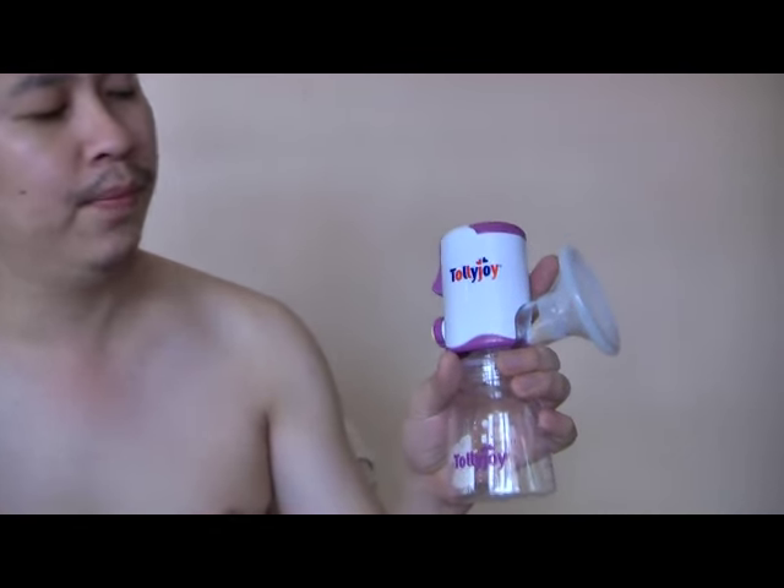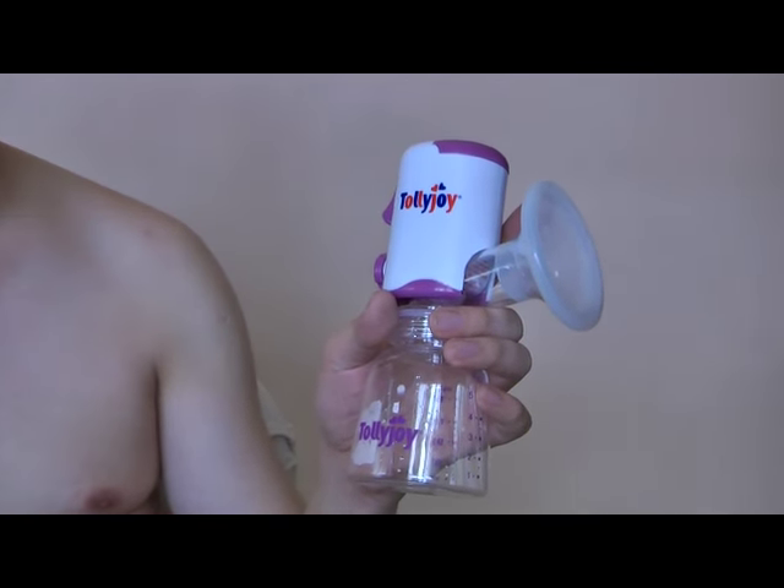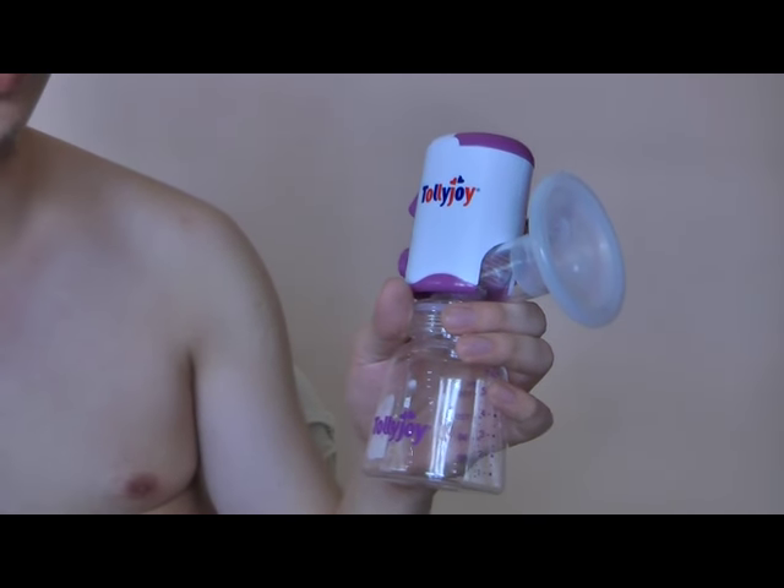Hi, my name is Vincent Cheng and I'm from NextGenParenting.com and today we are going to review a breast pump because my wife Joanne just gave birth to our daughter Victoria and we have tried some manual pumps and it's actually really time consuming so I went and bought this breast pump. This is a breast pump called Tollyjoy and it costs about 99.99.